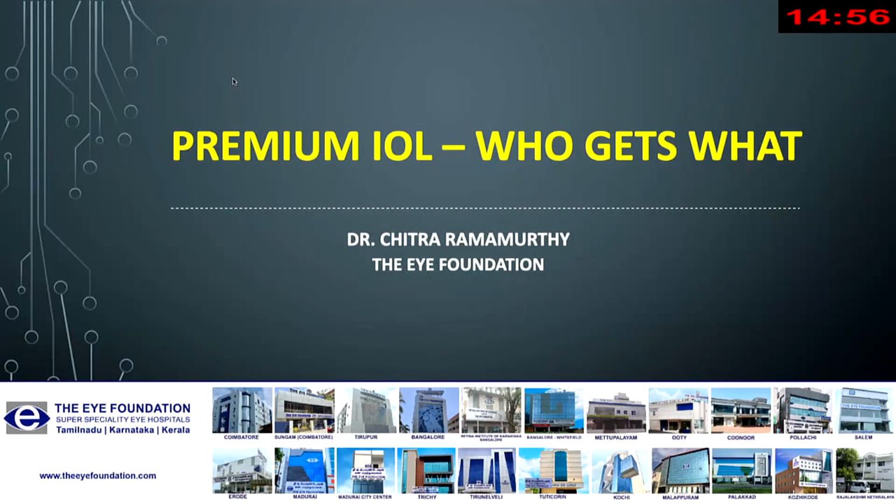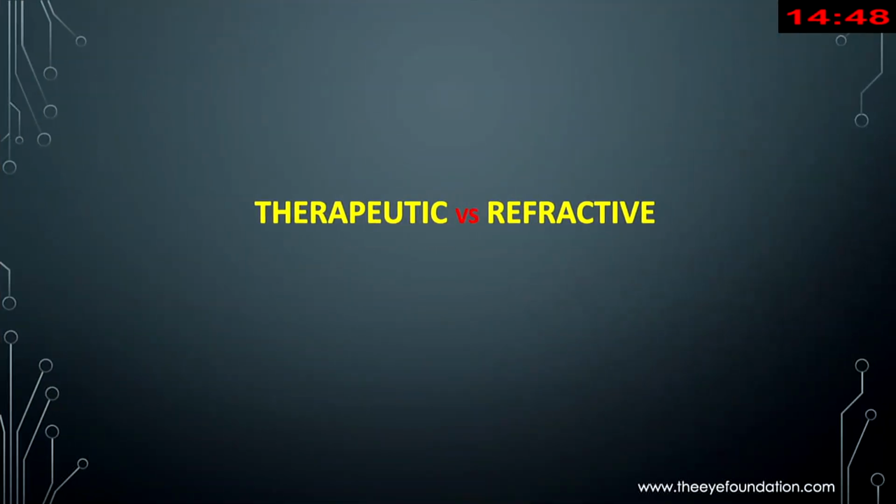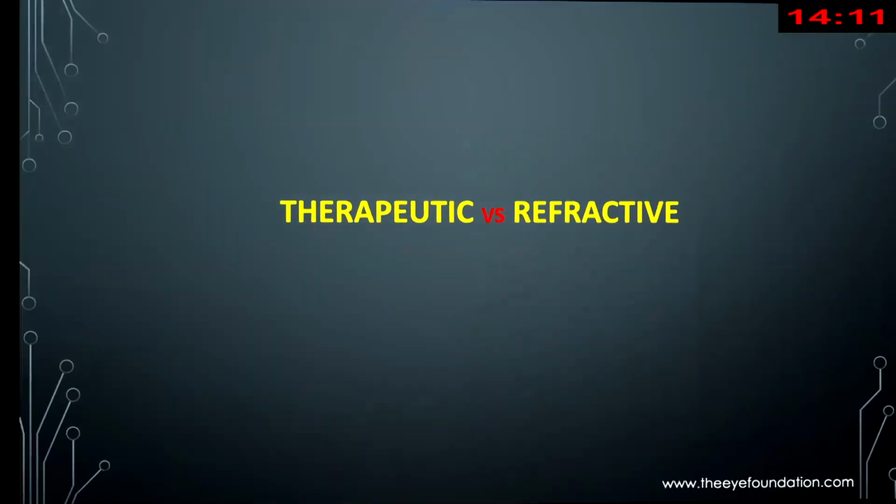So mind you, in the next 15 minutes I will brief you about premium IOLs and what helps us decide which patient to select. Basically, we stand at a point in ophthalmology where we are planning premium IOLs largely to replace the cataract and give visual independence without glasses. There is also a segment of patients who may have very early cataract or a dysfunctional lens syndrome, wherein some aberrations have started occurring in the lens, because of which the patient has a subnormal quality of vision and desires to have cataract surgery done.